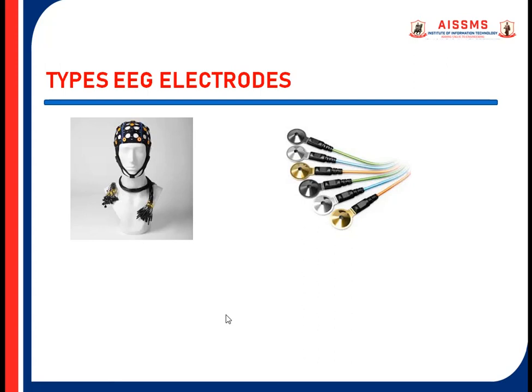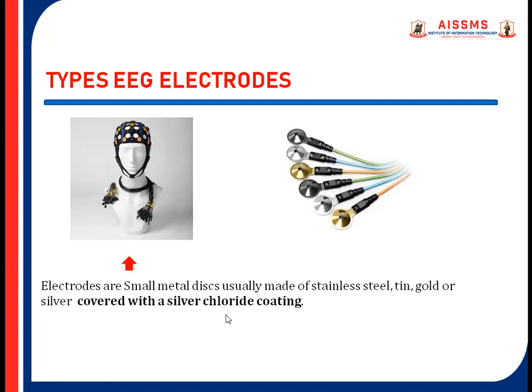Types of EEG electrodes. Electrodes are basically small metal discs made up of stainless steel, tin, or gold, and covered with a silver chloride coating.